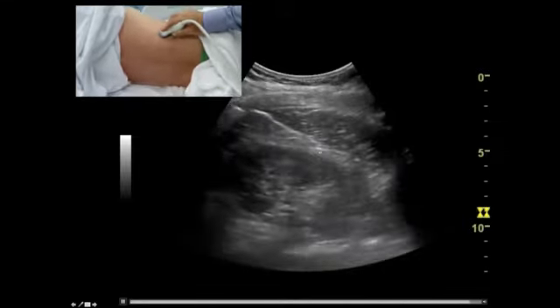There is the cortex, which you can see is the same echogenicity as the liver, just as it should be. So medullary pyramids and cortex. And then in the middle is that echogenic sinus, the fat-filled sinus, which is bright. And within that you get some hypoechoic collecting system.